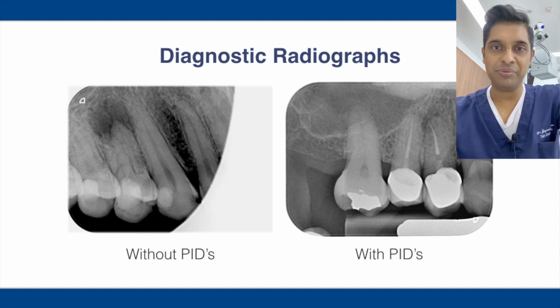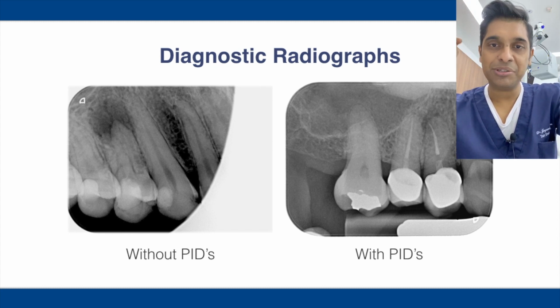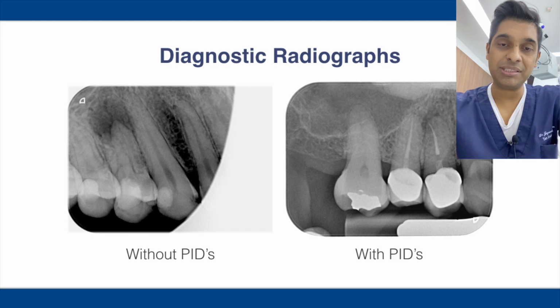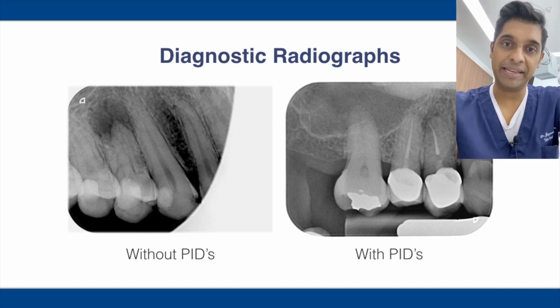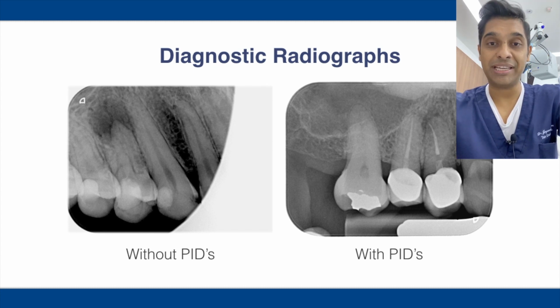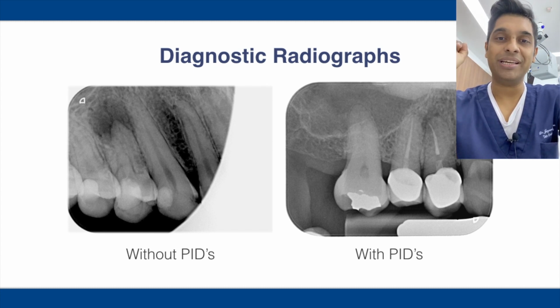So it's very important when you take x-rays, because you are going to hand over these x-rays to your patient when they walk out of the clinic. It is your reputation, because this patient is going to carry this x-ray, go to another clinic, and if another practitioner looks at this x-ray, probably for a second opinion, you want to make sure that your x-rays are proper.